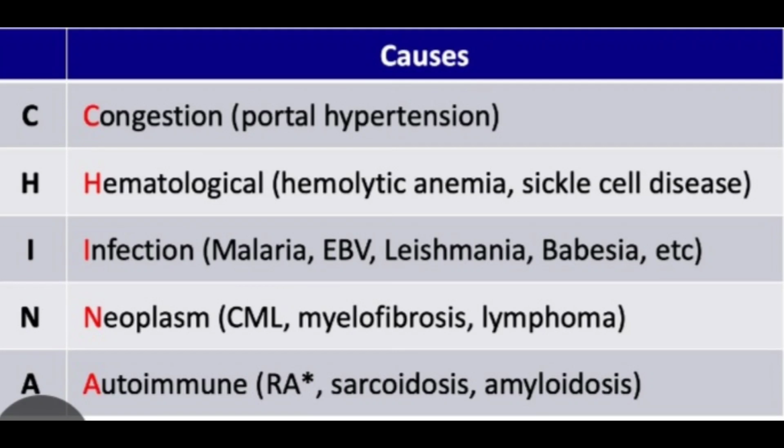There will always be history available. There will always be other investigations available. Whenever you come across an enlarged spleen, always look for the history, and always look for the other investigations to rule out the exact cause.